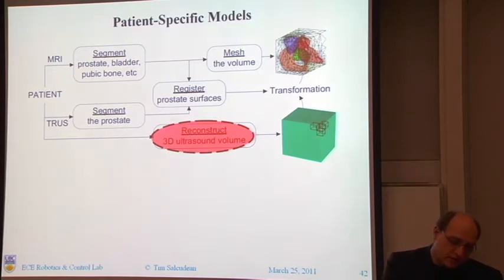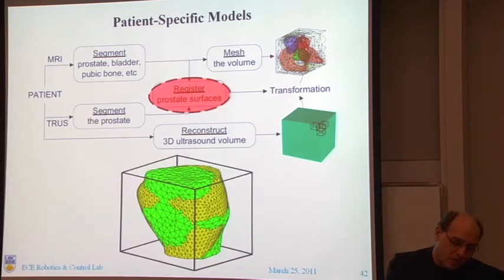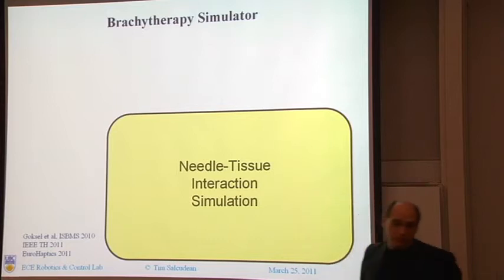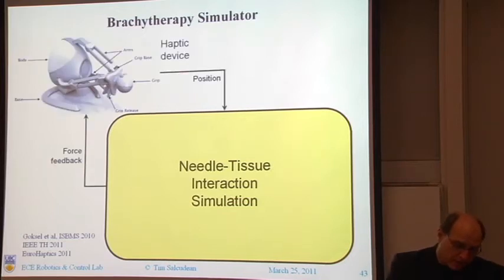We reconstruct a 3D volume. In this 3D volume, we segment the prostate. We match it to the prostate in MRI by using a registration process, and we end up with our model. This allows us to do needle tissue interaction simulations, the subject of the PhD thesis of Orchon Goxel, which can then interact with force feedback with a haptic device.